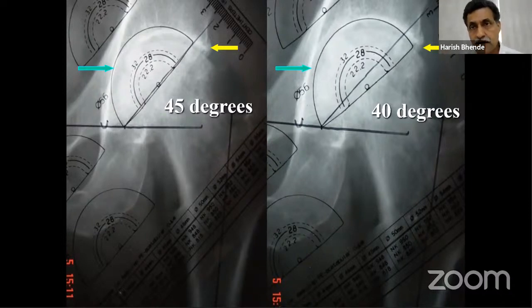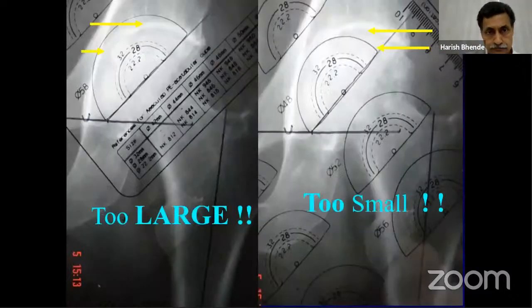So these anatomical landmarks which you see while templating help you during the surgery. It tells you exactly that during the operation, if I put my cup flush with the superolateral edge of the acetabulum and the lower end on the TAL, I would be 100% putting my cup at 40-degree inclination. So templating is not just what you see on the table about the size of a cup, but also which way, with respect to the anatomical landmarks, you will get the required inclination or anteversion.